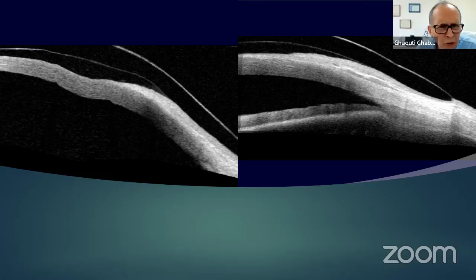Sorry, Ed. Do you mean that you don't use any more fluorescein and slit lamp? I do fluorescein slit lamp to make sure the edges are valid, but not to determine the fit. Okay, it's all done with OCT. So you think that OCT will be a gold standard for sclerals in the future? Absolutely, absolutely. There are several companies out there.